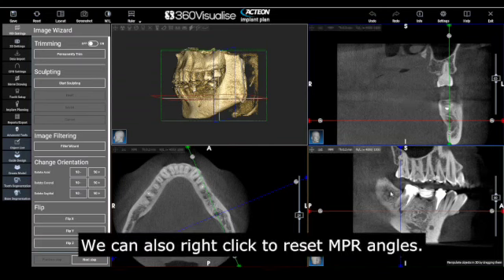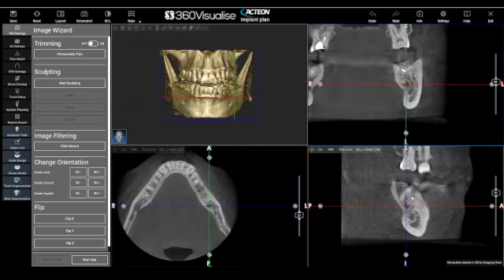You can right click to reset the MPR angles.